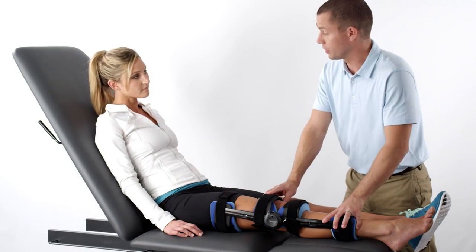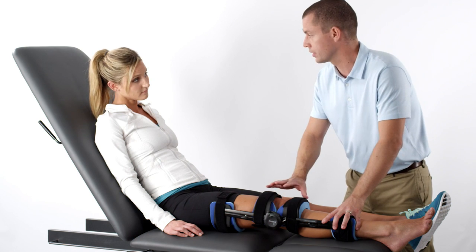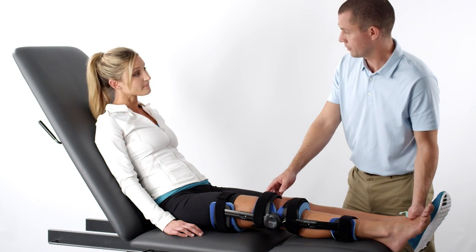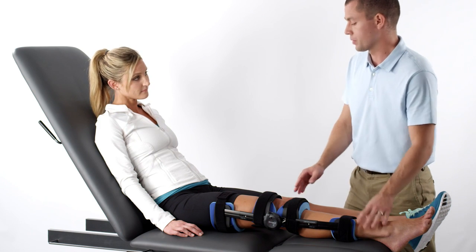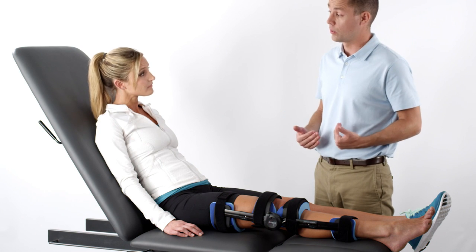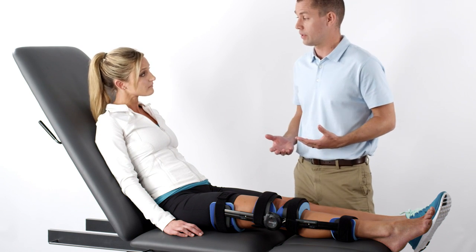Monitor the patient to determine their tolerance to the device. If the patient cannot tolerate the initial tension setting and wear time, a physician or therapist needs to reevaluate the patient. If the patient can comfortably wear the device during this initial period, the treatment time may be increased.